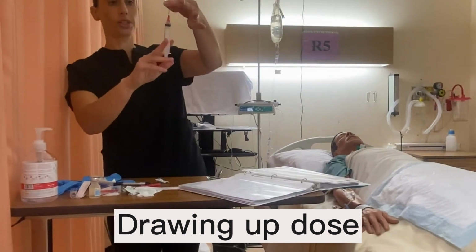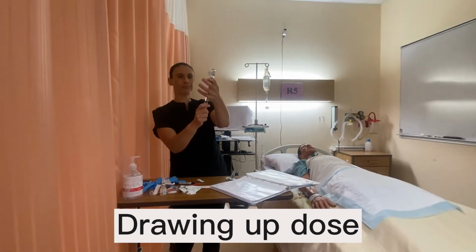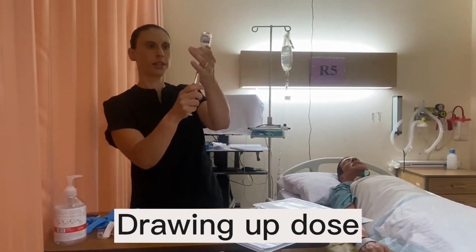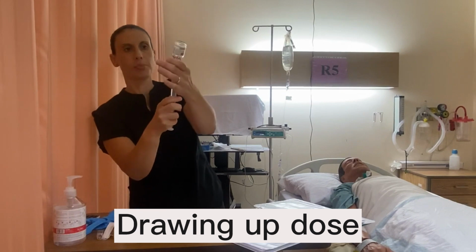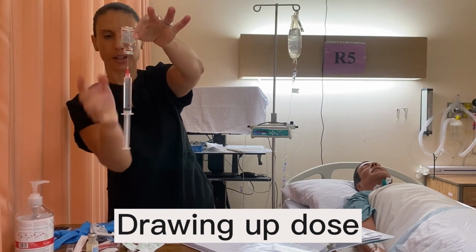Okay, and making sure that the needle is within the fluid so it can pull back all of that IV medication. And to make sure that you get the last little bit there, just keep pulling your needle closer and closer to the edge so that you could try to get all of that fluid that's sitting at the cap there, okay?